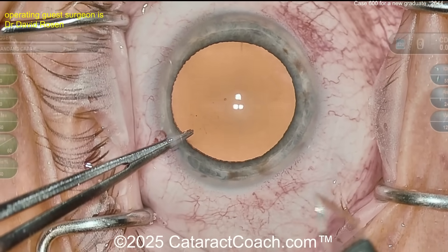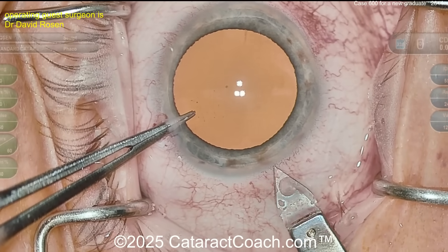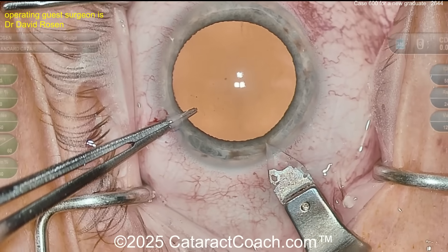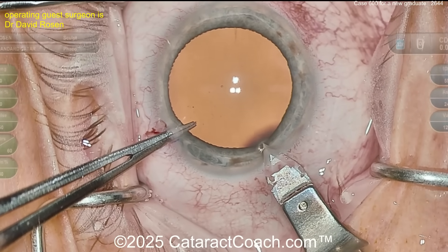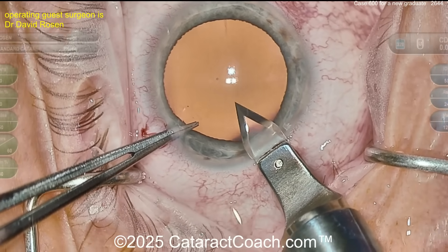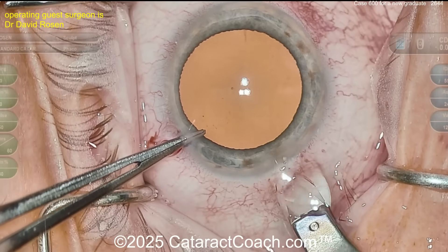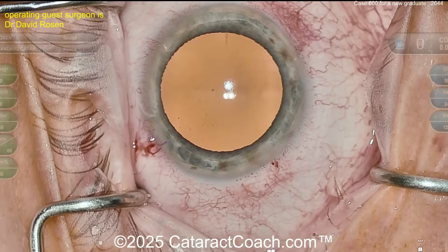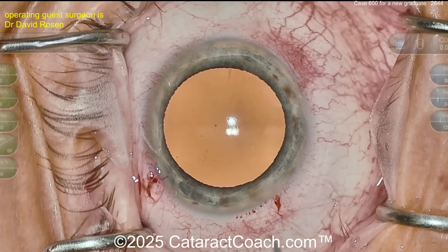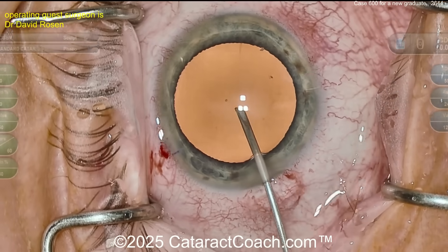Another diamond — I like the diamonds. Good job, now holding the eye with the forceps up to the paracentesis. Let's see the main incision — nice looking diamond keratome there, starting right at the limbal vessels, I like that too. Beautiful clean incision, good tunnel length, that looks great. May need to widen it up — slightly widening — that's beautiful. Wow, great looking incision. Both incisions nick the limbal vessels, I like it very much.